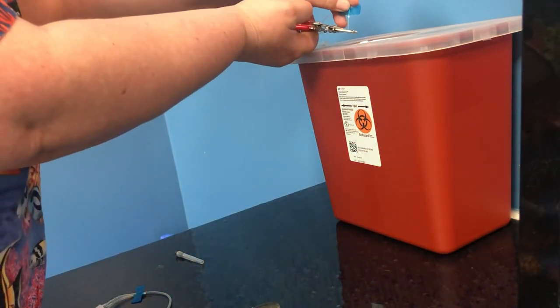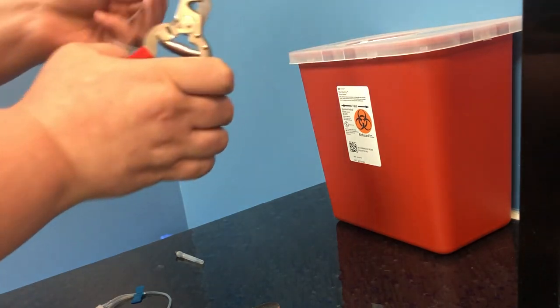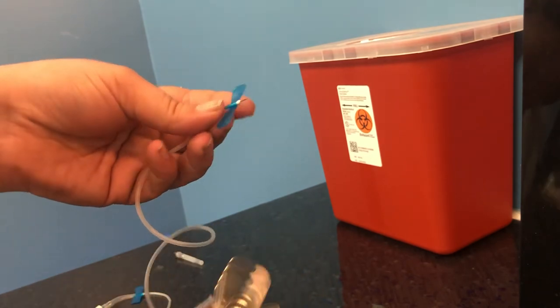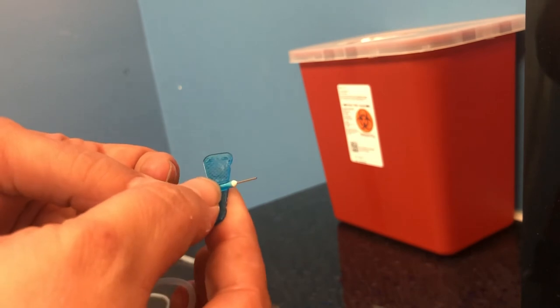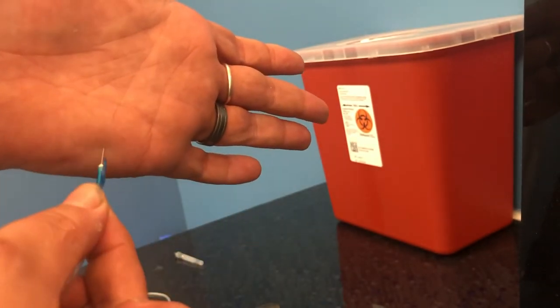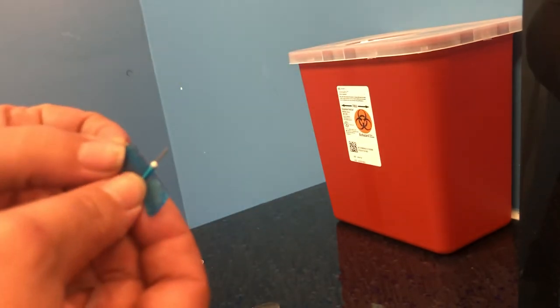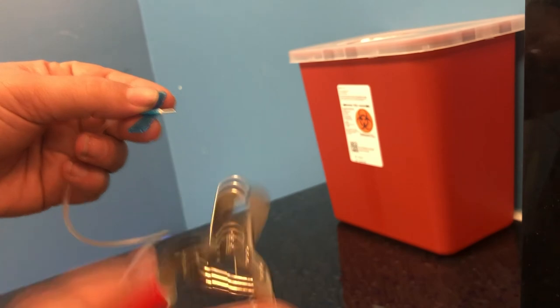Try and turn this so you can see it. I'm gonna give it a little clip. And then what happens is the sharp part safely is deposited into the sharps container, and I'm left with a relatively blunt tip on the butterfly that I have cut down. When I apply this to my skin, it's still a tiny bit sharp, and there's a little barb on one side because of how the nail clippers crush the tip of this.